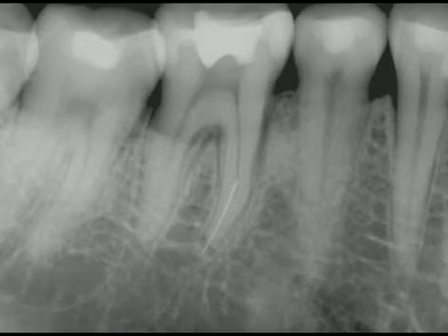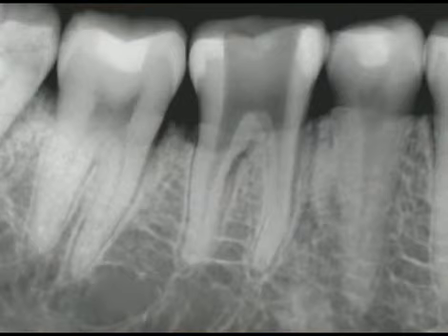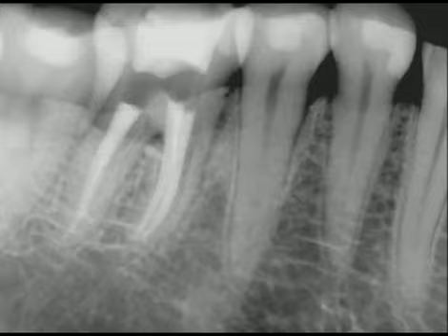In this preoperative film of a mandibular first molar, notice a broken instrument in the apical 1/3 of the mesial root. Notice the root is thin, and the angle between the file and the coronal 2/3 of the canal. A photograph shows straight line access and the head of the broken NiTi file predictably lying on the outer wall. I utilized a prototype IRS device to scoop up the obstruction, and a subsequent radiograph confirms the removal of the broken file. The post-treatment film demonstrates the pack. Notice the furcal canal and the distal system bifurcating apically.